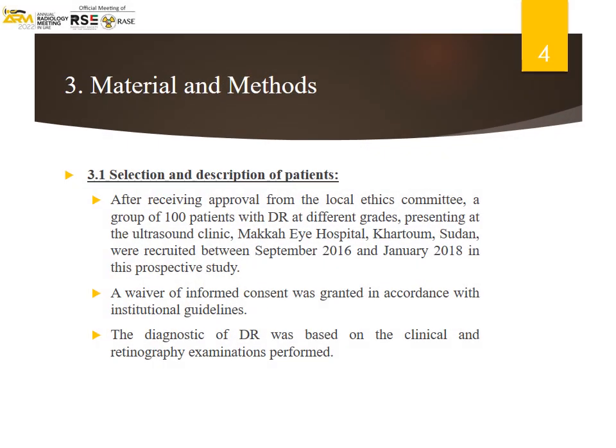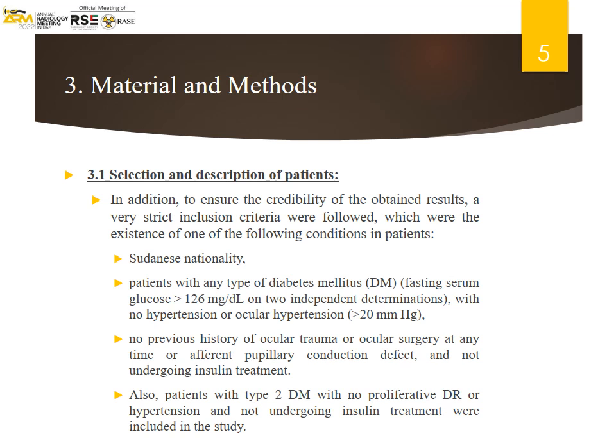Following authorization from the local ethics board, 100 patients with diabetic retinopathy of varied grades were recruited between September 2016 and January 2018. The first item in the Material and Methods section is the criteria for patient selection and description, which are as follows: Sudanese nationality, diabetes mellitus, no hypertension or ocular hypertension, no history of ocular trauma or surgery, no afferent pupillary conduction impairment, and no insulin administration.